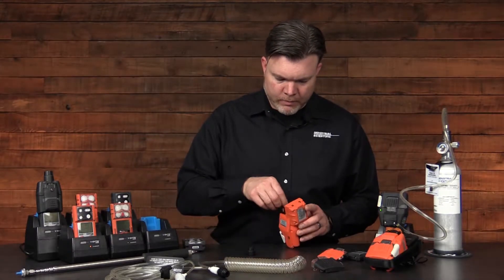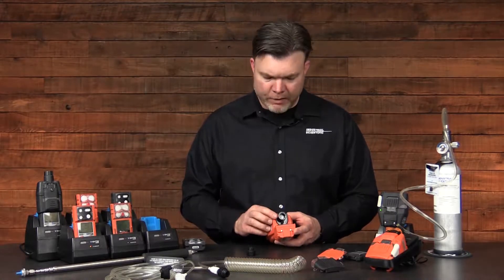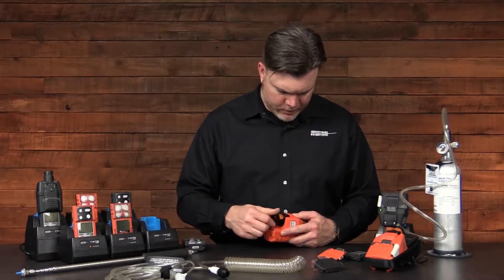When the filter is installed, ensure that the white element is facing up or out of the pump, ensure that your cap is in good repair and has an o-ring installed, and reinstall your cap.